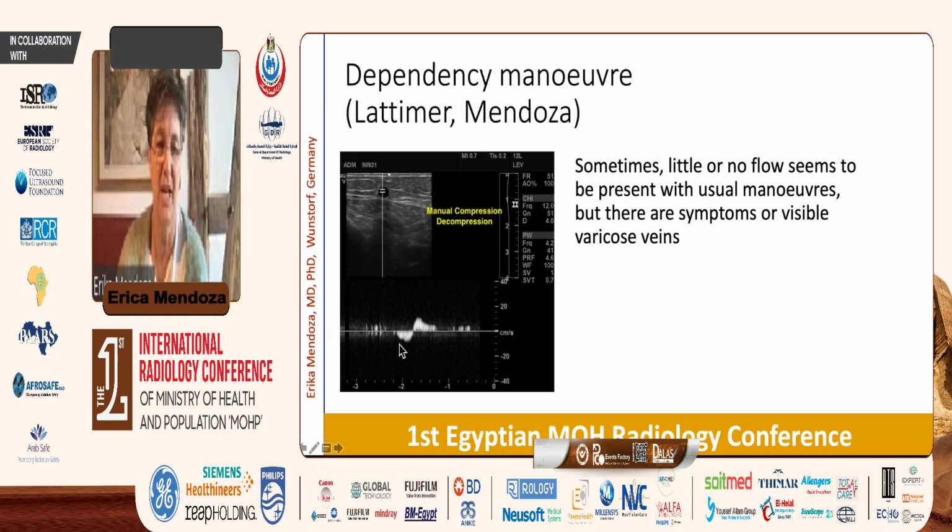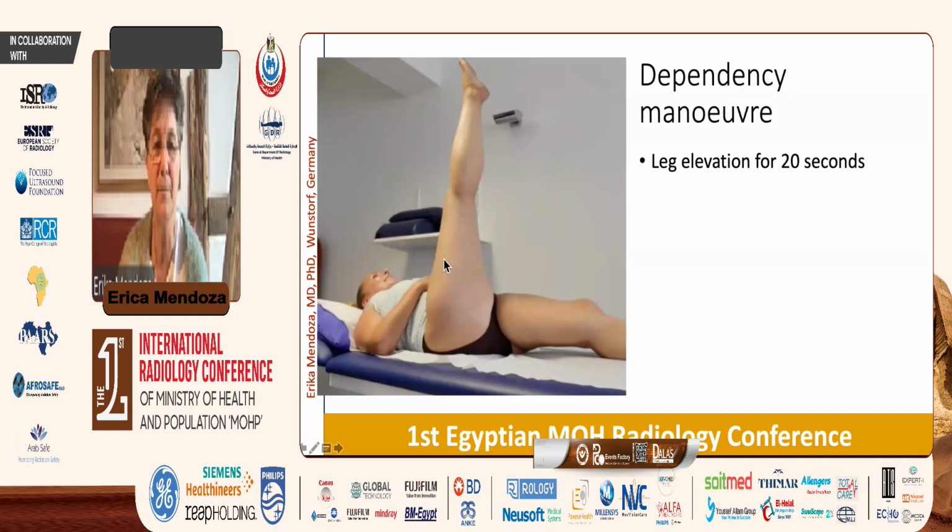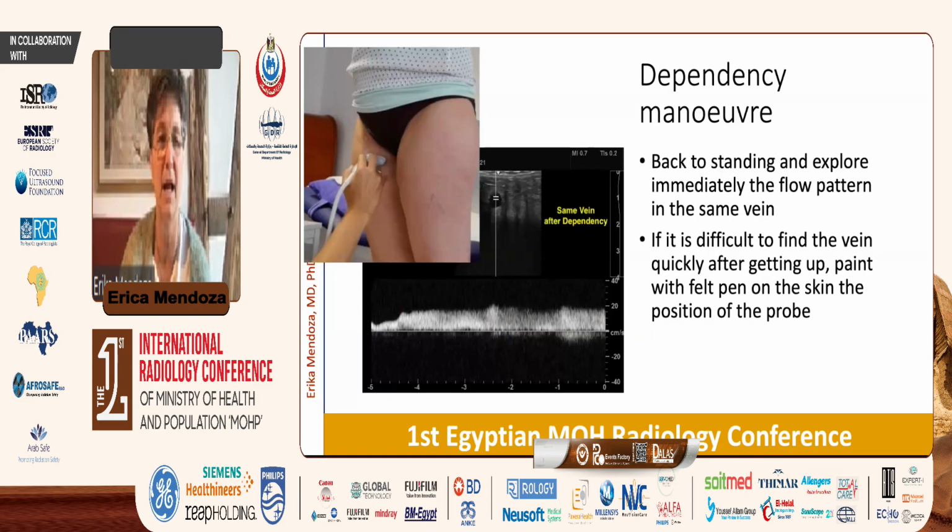This is the case, for example, here. You see there is a varicose vein, there is a slightly enlarged vein. And if you put the patient recumbent with the leg up for 20 seconds and then put him again back to standing, this is exactly the same vein, but just after laying down and standing up. And sometimes you miss a varicose reflux if you don't do this.